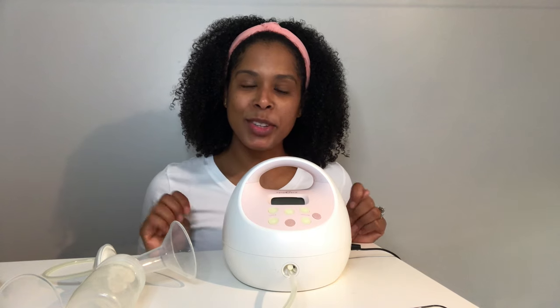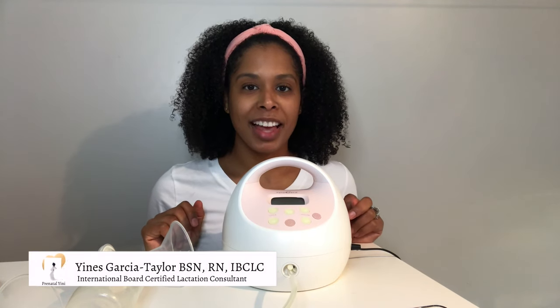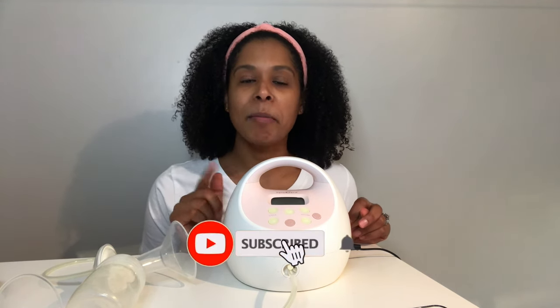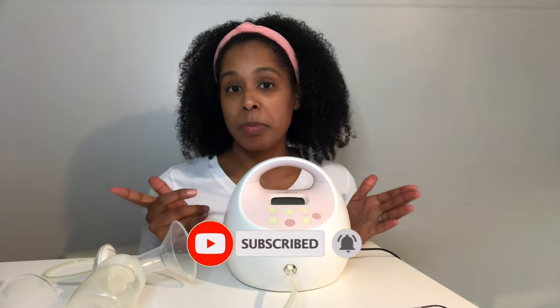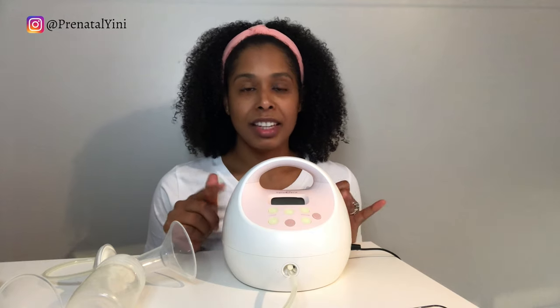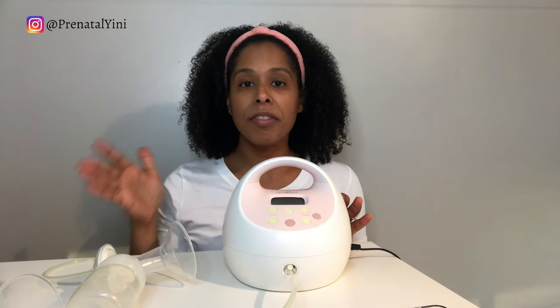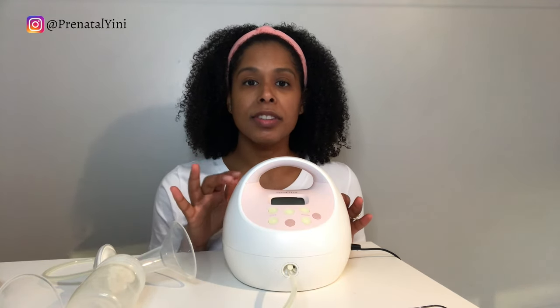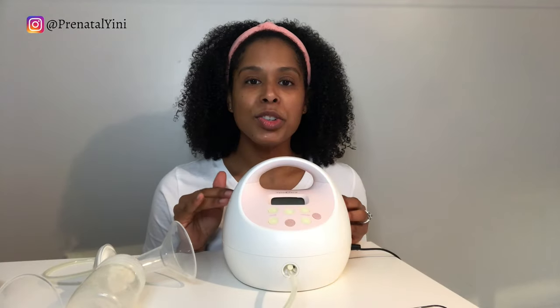Hi, welcome back. My name is Gina from Prenatal Yini. I'm an international board certified lactation consultant, a registered nurse, and a mom. In today's video I'm going to show you how to use your Spectra S2 or Spectra S1 — how to use it, how to set it up, and the best settings to use to get the most milk.